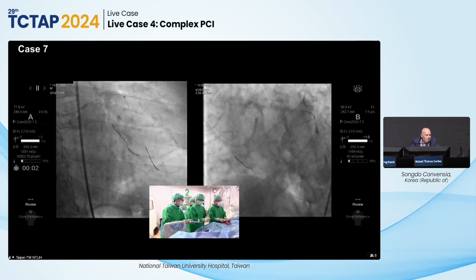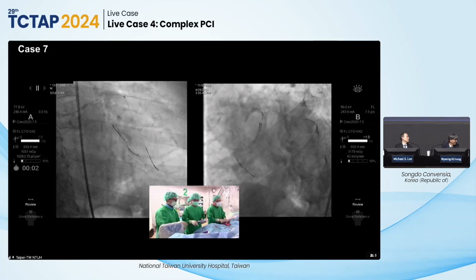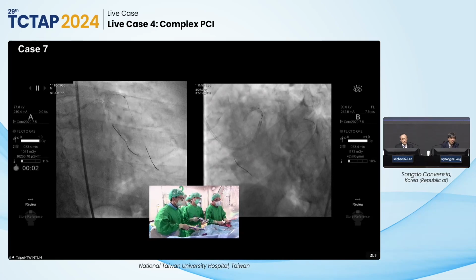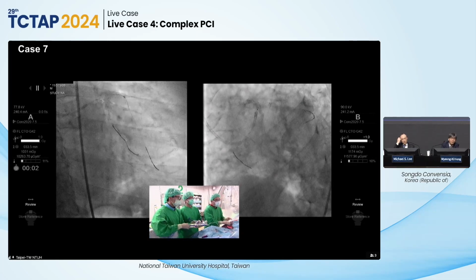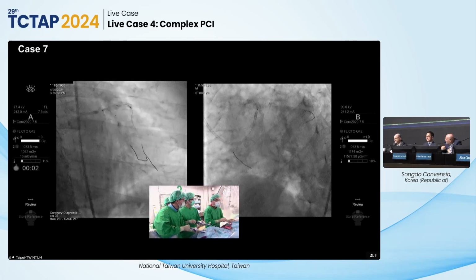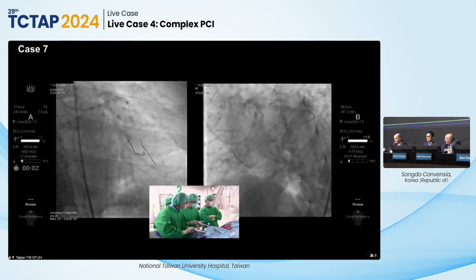But I think you could take another balloon and just swap them. Yeah, but the question is whether the IVL balloons are contacting each other, whether you get synergy. I don't know what happens at that interface, because the acoustic wave is actually bigger. It's like 2 waves coming. Okay, let's maybe go.